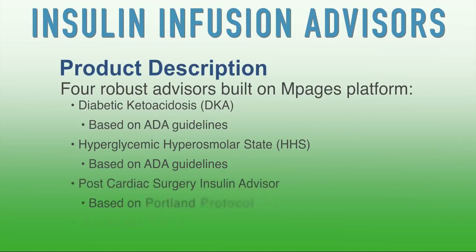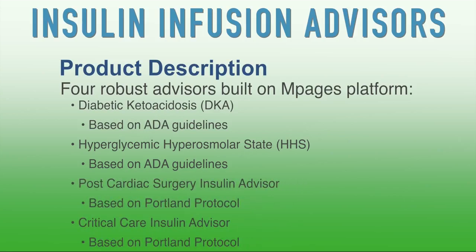The third and fourth advisors are post-cardiac surgery and critical care insulin infusion advisors. These are based on the Portland Protocol. These advisors have helped standardize and improve care for patients with these conditions at multiple facilities.